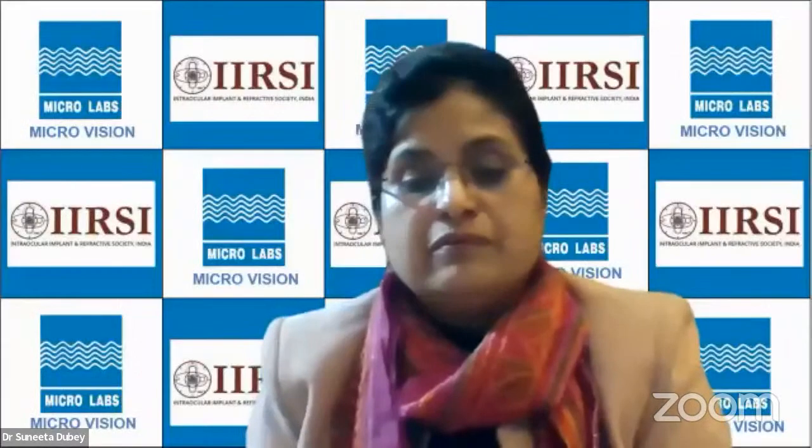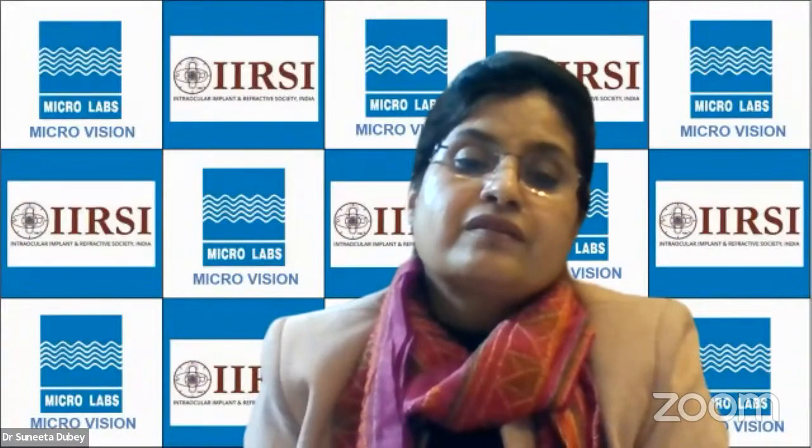Sometimes with remodeling, as Dr. Madhu pointed out, just give some time with steroids and massage and observation. Yeah. Some of these things actually remodel and the bleb gets sorted out and becomes diffuse again. So I think the follow-up and observation is the key. You do need to look at it carefully.